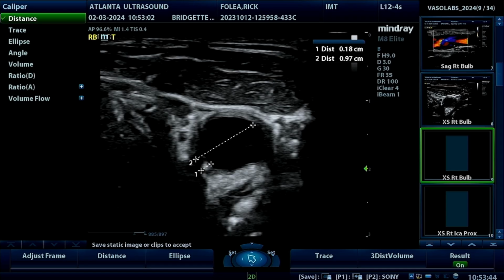Now these are just exploratory measurements to show you how a measurement could be taken. This is not the CIMT measurement. We'll do the CIMT measurements after we've looked around some more. But I should mention that normally we would measure vertically. We would also be careful to account for the wider opening because we're entering the bulb here. We did this example at an angle just to make it easier to compare these two measurements side by side.